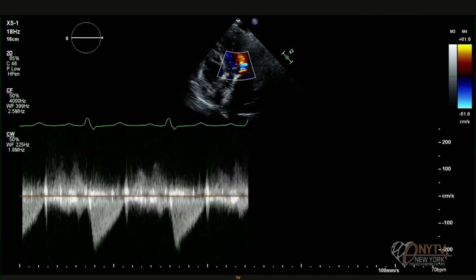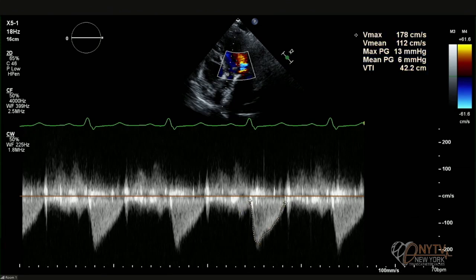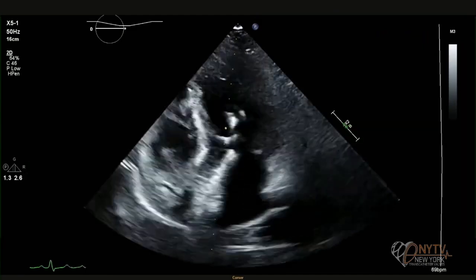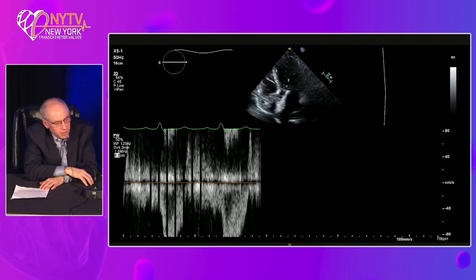I think we can leave it. Leave it. But if you have to post-dilate, what size? Tell the audience. I think it will be 21 true, if I'm not mistaken. Anyone here would post-dilate? I mean, I think it looked a tiny bit constrained still at the annulus angiographically, but you don't have AI, you don't have much of a PVL, so I think you don't need to.